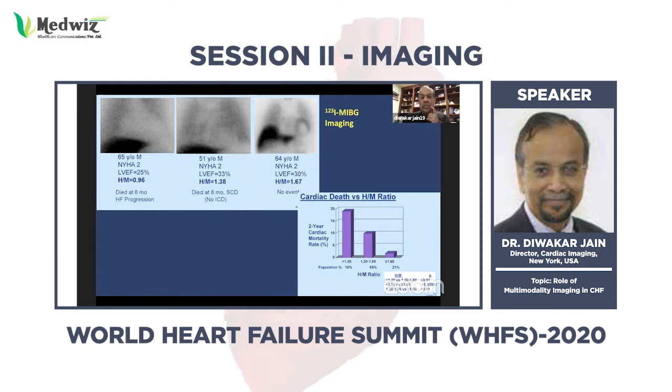Now, the question whether successful treatment would result in an improvement in the radiotracer uptake, that is unknown. Can treatment be guided? Can you select patients for ICD implantation, which is done quite commonly in patients with impaired left ventricular function, rather than relying upon ejection fraction? Those remain unanswered questions, but the studies have shown it to be a powerful technique.